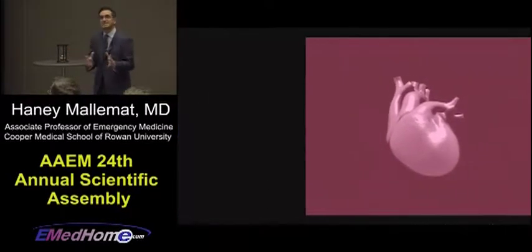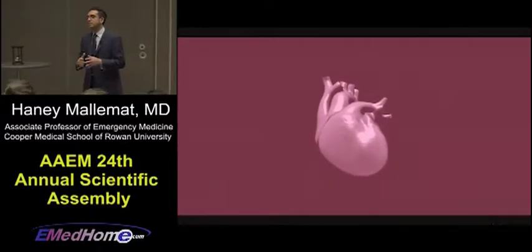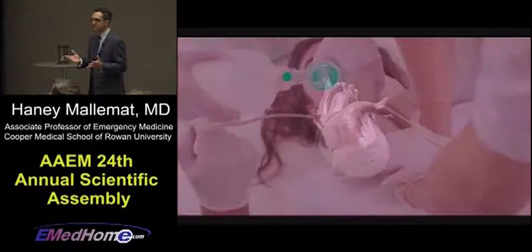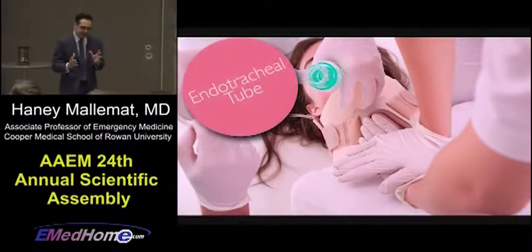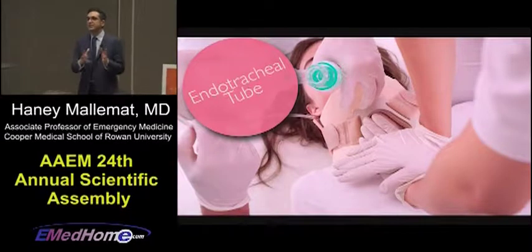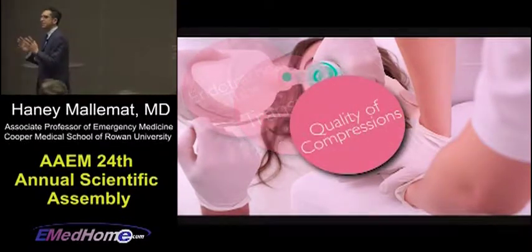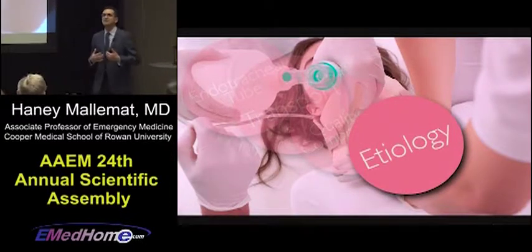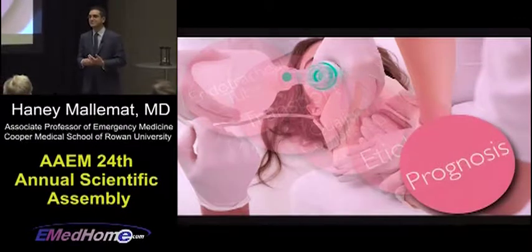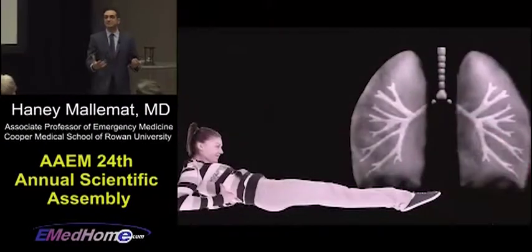We can also make an assessment of the cardiovascular system, and this is huge. Now, when we're talking about cardiac arrest, we know that this is vital. You know about using end-tidal CO2 during endotracheal tube placement. You know it's recommended for patient transport, but it also helps us with the quality of our compressions. It also might help us to determine the etiology of the person's cardiac arrest. And most importantly, it tells us the prognosis of that patient as we're resuscitating them.